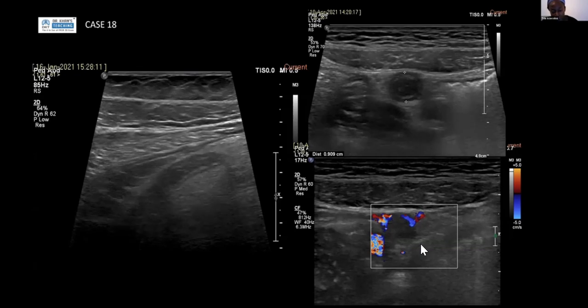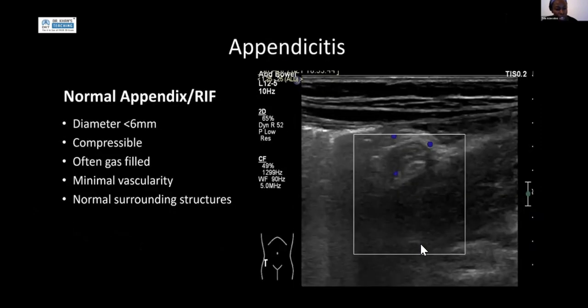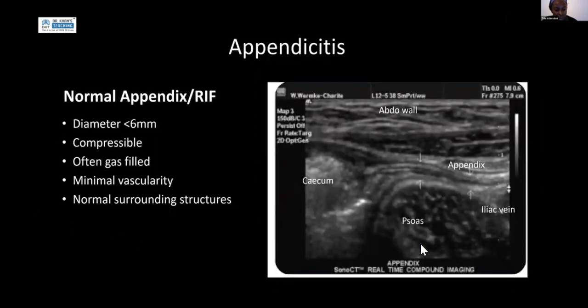So I keep my probe in the same position and gently move it down the abdomen, keeping a good pressure, trying to dispel those bowel loops. I might stay in one position for a little bit of time to encourage the bowel gas to dispel away. And then I'll move my probe down, find my cecal pole as my anatomical landmark. Go forwards 2 slides for me, Sam, maybe 3 to show the anatomy. Find my cecal pole as my landmark, and then I will look for my ileocecal valve because I always check my terminal ileum in all these patients.